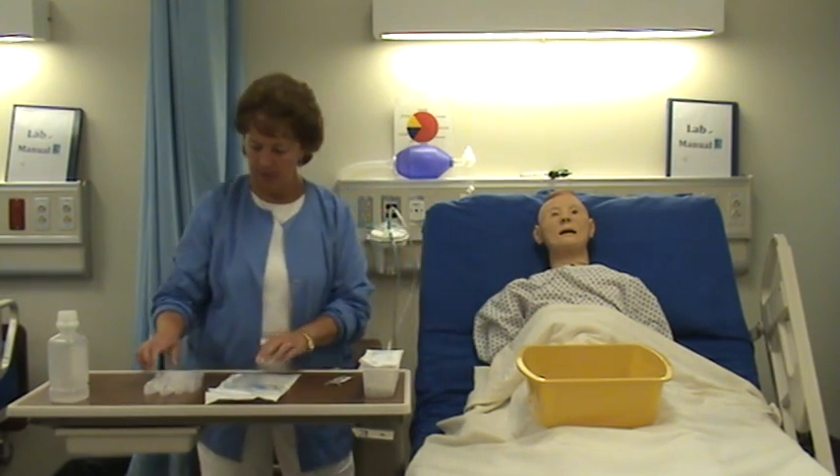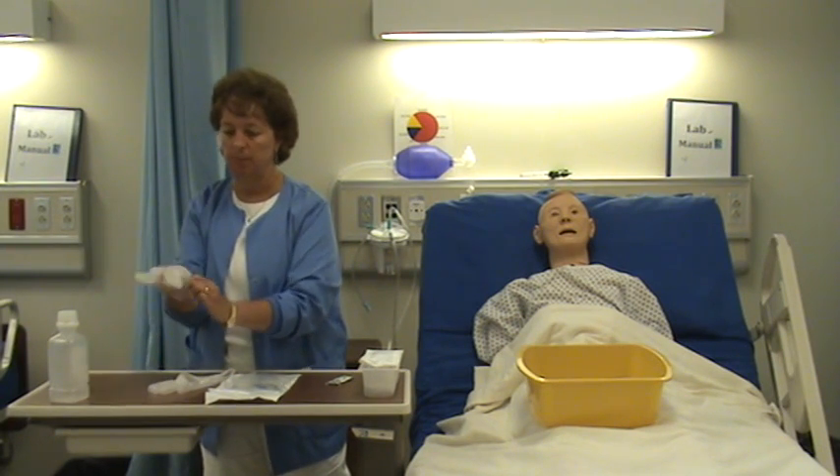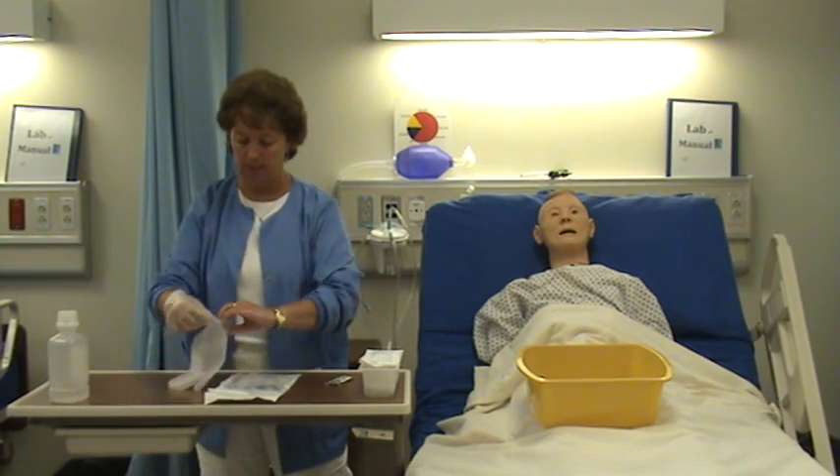After explaining to the patient what I'm going to do, I'll put on my clean gloves. It's not a sterile procedure because we're going into a clean cavity, not a sterile cavity.